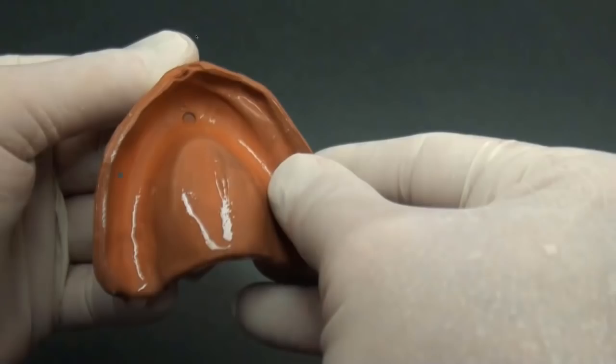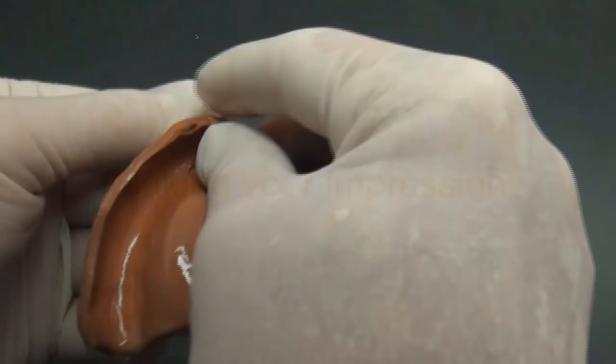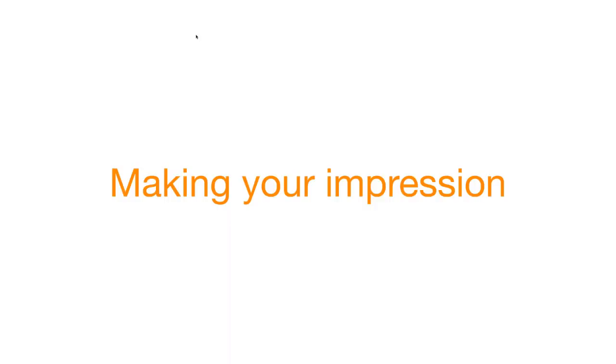Once you like the shape of the tray, place it in cold water and it hardens back to its original hard state. Now let's go ahead and make an impression. We've got to get all this work done in appointment one in 30 minutes. I recommend this technique, but honestly you can use whatever impression technique and whatever impression material you like.